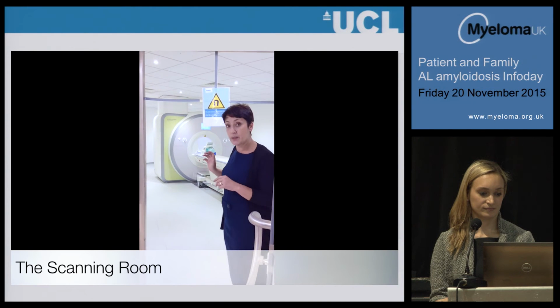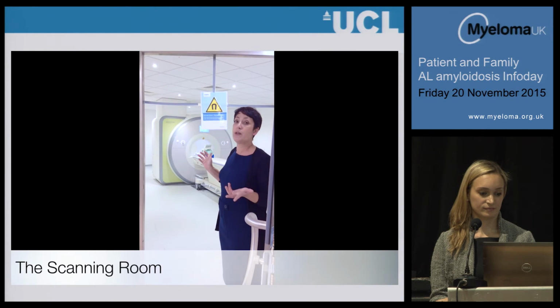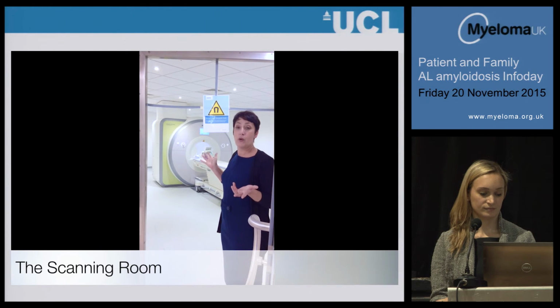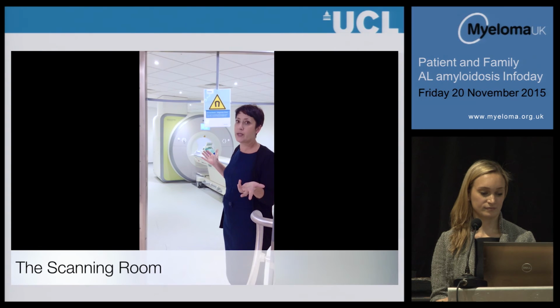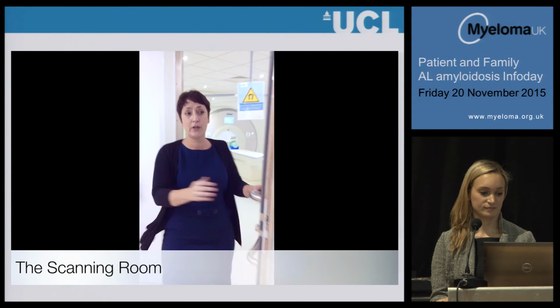There's an emergency buzzer with you the whole time, so should you have any problems with the scan itself or you're feeling uncomfortable, you can squeeze the emergency button and we will obviously come straight in to see you. Now let me just show you the control room.